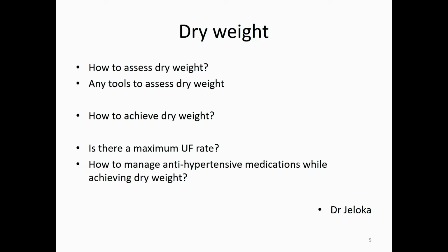I agree, but in some of the patients who are coming twice a week, it is very difficult. They start getting hypotension at the 4th hour or 5th hour. And if you put more ultrafiltration rate, which is hazardous, especially elderly people who have hypotension and collapse after that. So these patients, what we started doing is only 5 hours because they can't come for a third time. So do it for 5.5 hours if their time permits. Most of the people agree. So reducing the ultrafiltration rate and extending the duration, we are able to achieve the dry weight in such patients.